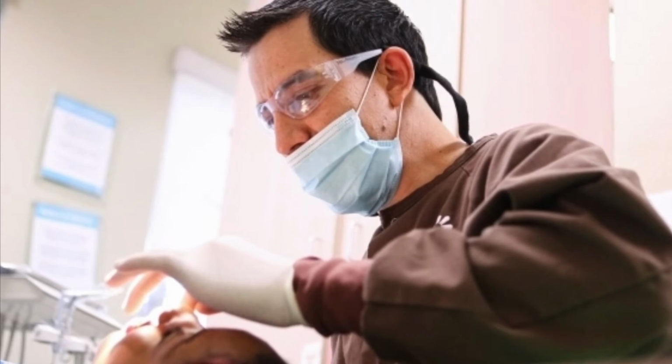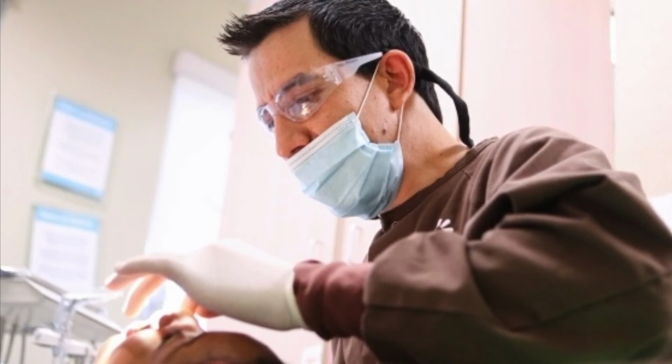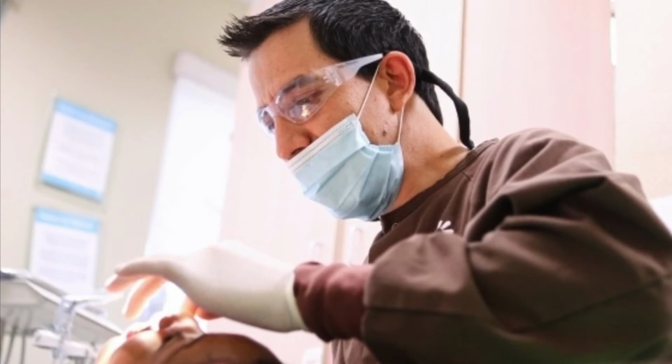Then, using the radiograph, know the average length of each tooth and place the file selected to the correct initial width into the canal with its rubber stopper set at the estimated working length.